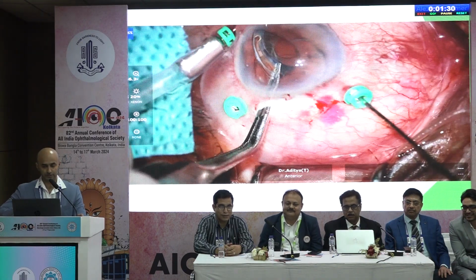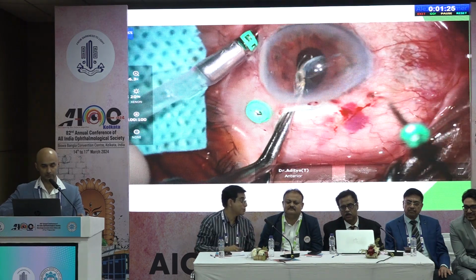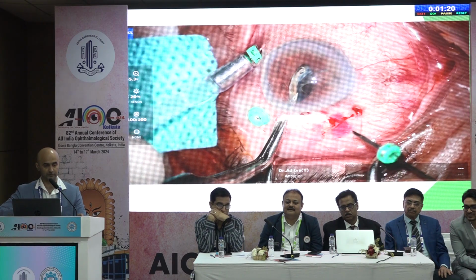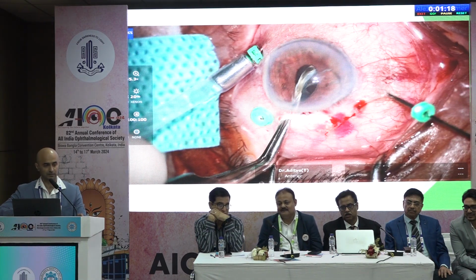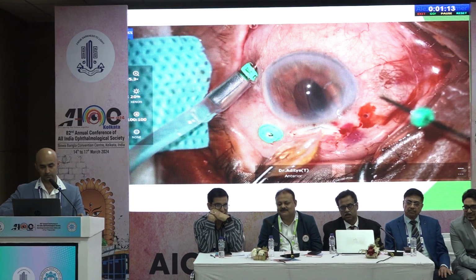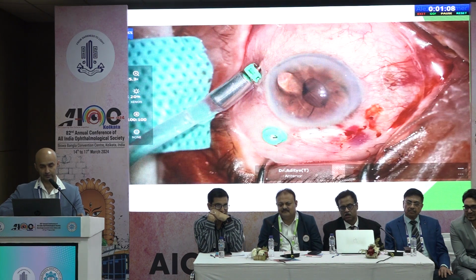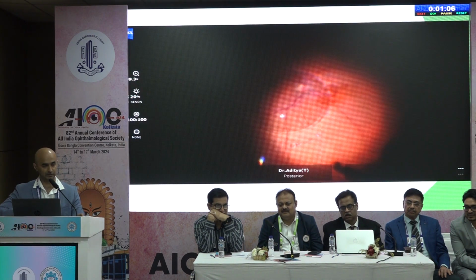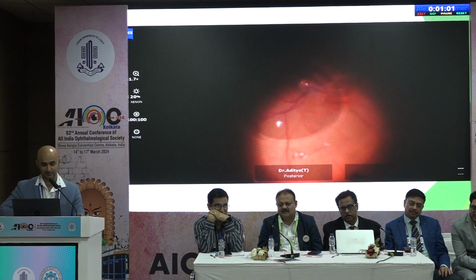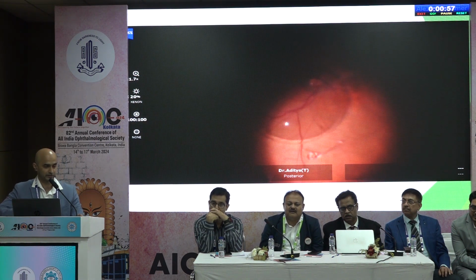But here my forceps get entangled with something, and now I cannot even leave the lens out. So I unintentionally drag the capsular tension ring from the side port, and the intraocular lens is now in the middle. So I leave that alone and bring the IOL bag complex out. But as I realized that it's not a complete ring, on the lower side it appears to be complete, and thankfully I had the PFCL behind, so I could go back and check, remove the PFCL, and also removed this segment of capsular tension ring which was left behind.